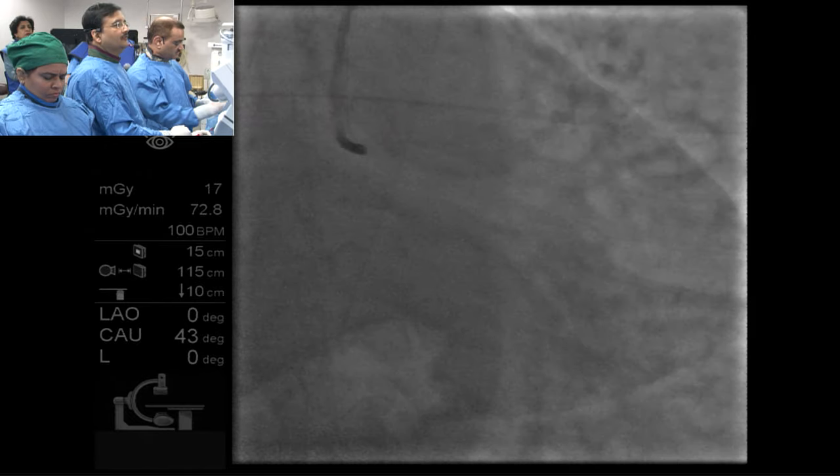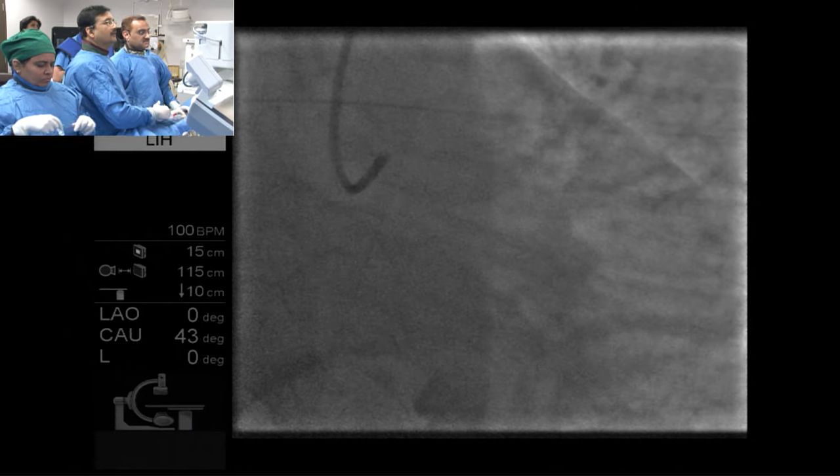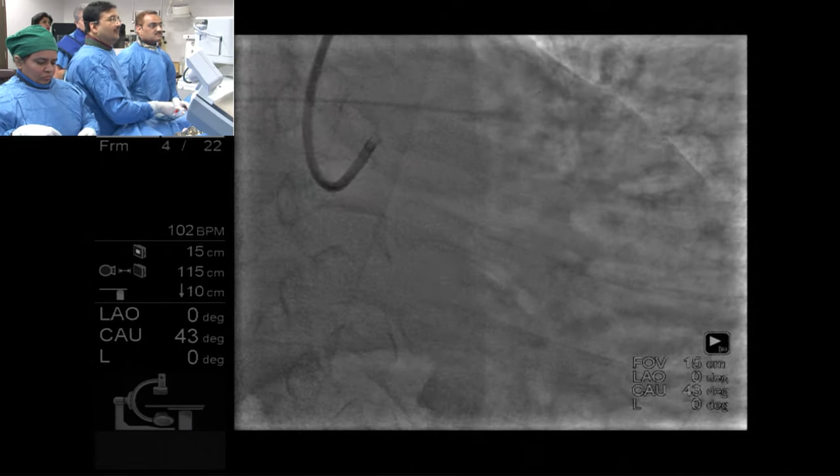We take a view so that they can see. Yeah, let's take a look. Hold a second, let me seat it better. You want to push the guide a little bit in, maybe? Yeah, there we go. Now you're engaged. Looks like you are a mind reader, Samir. Okay. Pressure is okay still? Yeah, good, good.